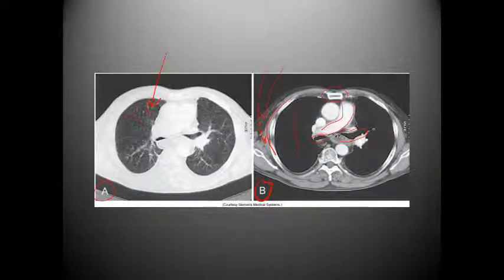However, we can't see the internal structures of the lungs, and so this would be assumed to be a medium width, and notice this will be a fairly middle window level, so you're getting equal amounts of white and black.